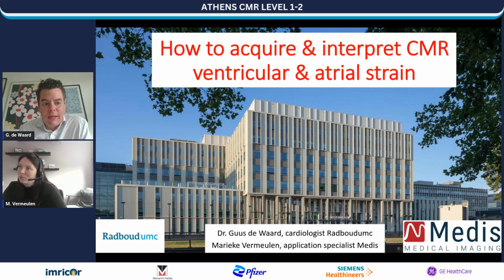how to perform the quantifications of left and right ventricular volumes and ejection fractions, and discuss the theoretical basis of ventricular and atrial strain. And then we'll follow it up with a few cases and show you live how to perform these measurements with the new automated Medis software, which is also available for a trial period if you ask Medis for it. That's very nice, and I would recommend trying that out. So to start off, I'll give the word to Marieke, who will kick off.